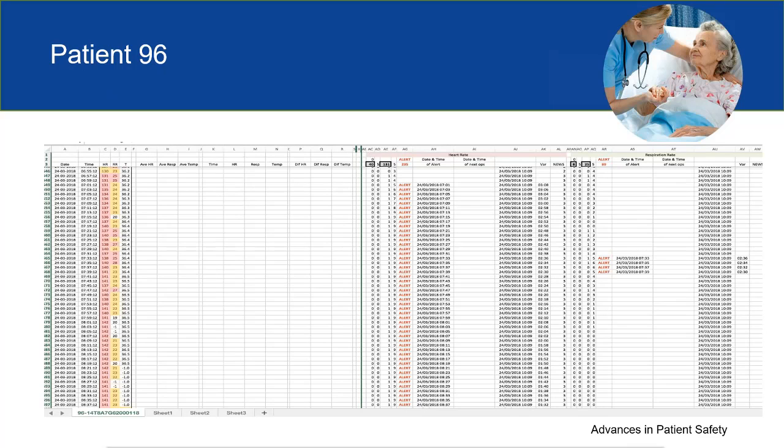So this is an example of one of our patients that showed real-time deterioration. On the left of the screen, I'm sorry it's small font, but we could see a sudden colour change in accordance with the new score. And suddenly you can see a column that's pink, and that's C. And this was at 7 o'clock. This model was created by Mr. McAndrew, who's our digital lead analyst at Chelsea and Westminster Hospital.